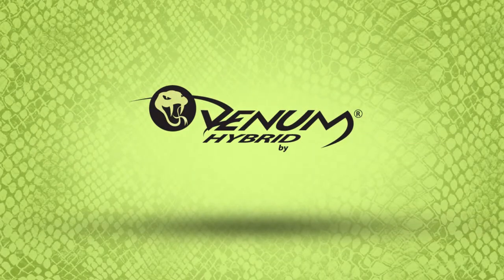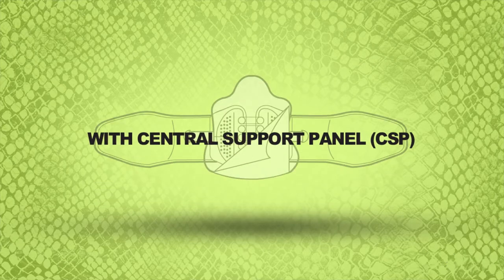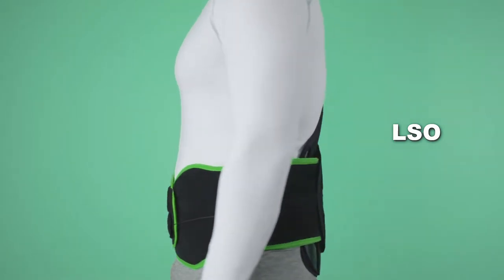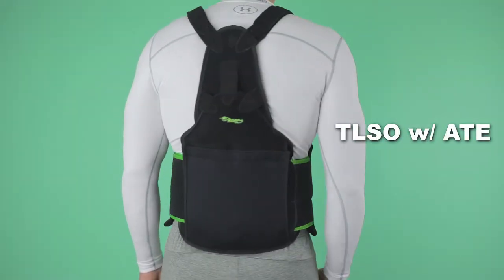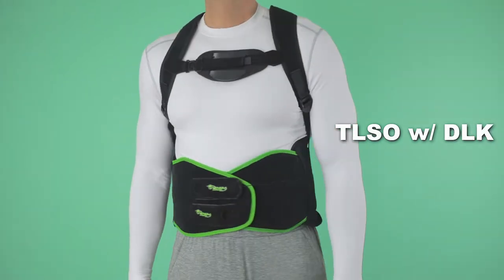Optech USA is proud to introduce the new Venum Hybrid One Size Fits All Spinal System. The Venum Hybrid is available with one central support panel in an LSO, TLSO with ATE, and TLSO with DLK configurations.